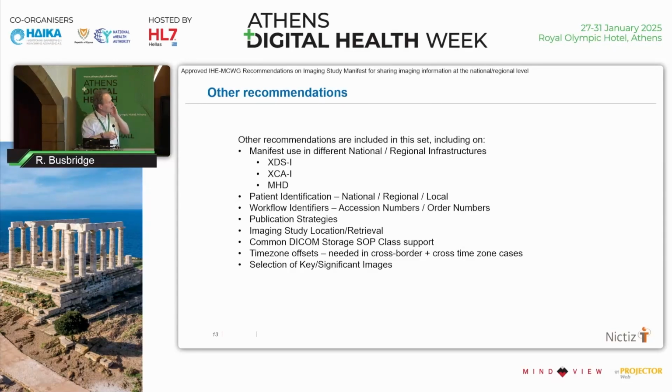We talk about publication strategies, for example. When are you actually going to publish your manifest? At what point? Do you publish it immediately that your study's complete, or do you wait, for example, until your report's been approved? There are different strategies. We mentioned that in the recommendations.